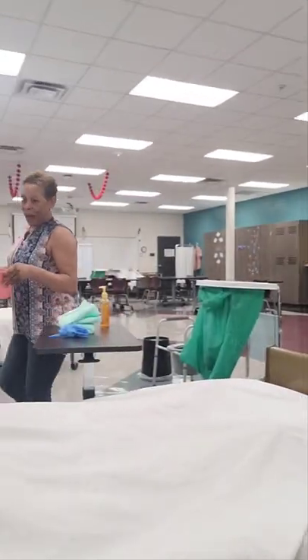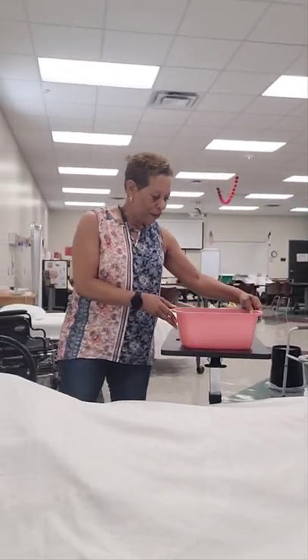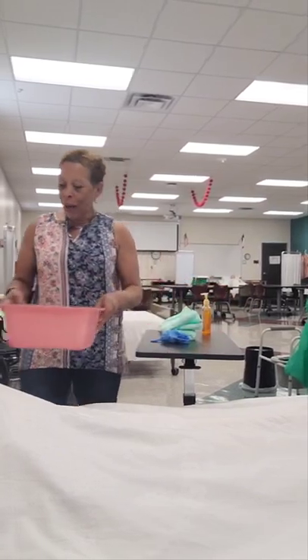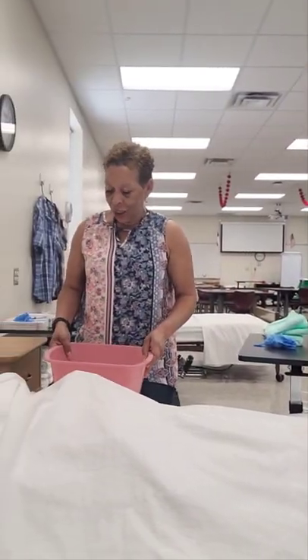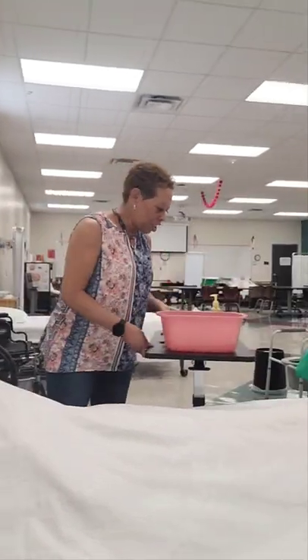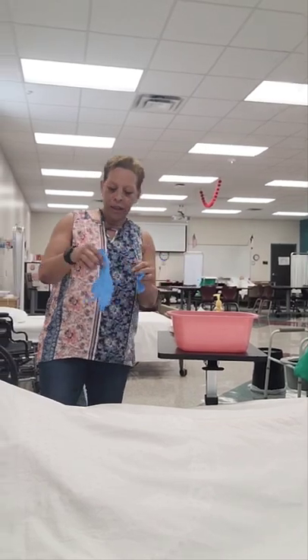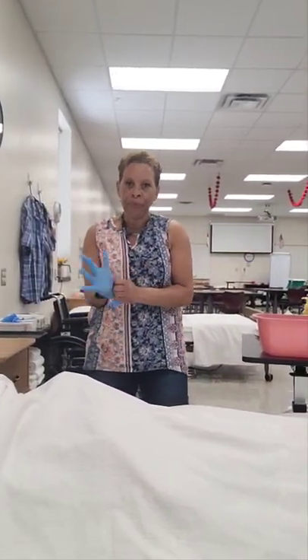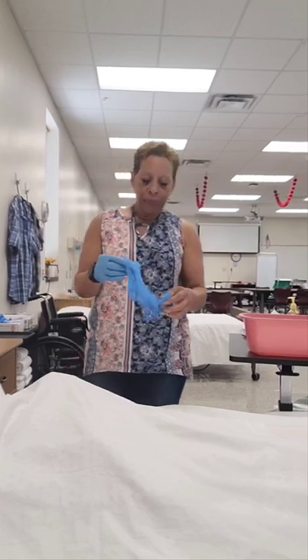Hi Mrs. Jones, I'm back with the bath basin. I have it filled with water and I've tested it — it feels good to me, but I would like for you to test it to ensure it's a comfortable temperature for you. At this time the NAE should speak for the mannequin. It feels good? Awesome. Mrs. Jones, I'm putting on my gloves because I'm going to place the linen protector.